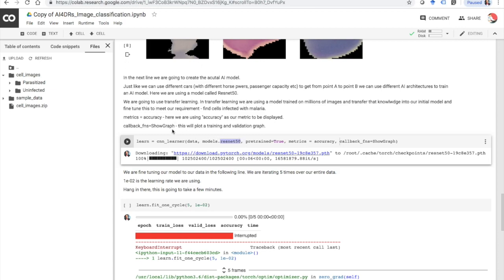In this lesson we are also using something called transfer learning. This ResNet 50 model is trained on millions of images and knows how to classify a lot of images, but not malaria. We are taking that pre-trained model and fine-tuning it so that it can classify cell images with malaria. We are also using accuracy as our metric, which will be printed once training starts. And we are using a show_graph function that will show a graph of training and validation loss. Let's run that cell now.